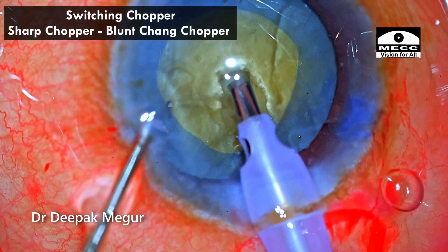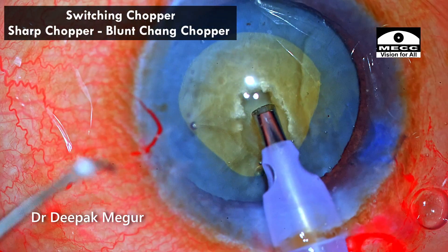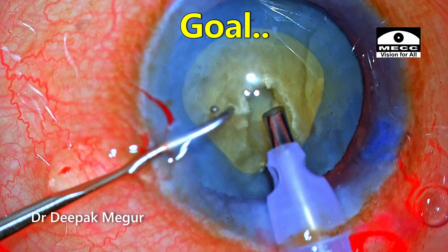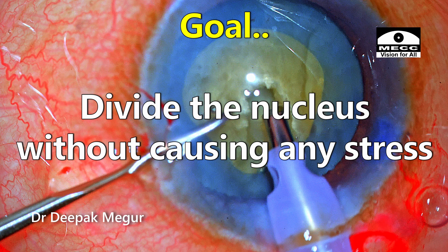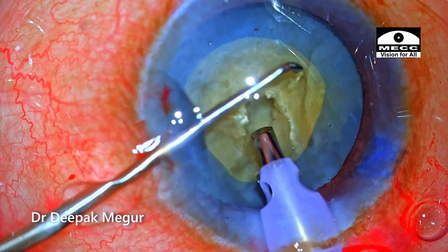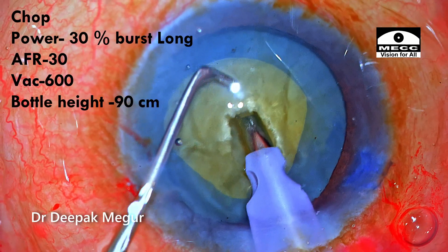I'm switching from a sharp chopper to a blunt chopper — this is the Chang chopper, which is going to hook the endonucleus. The goal here is to divide the nucleus without causing any stress on the rhexis margin, the bag, or the zonules, and the horizontal chop technique achieves that.